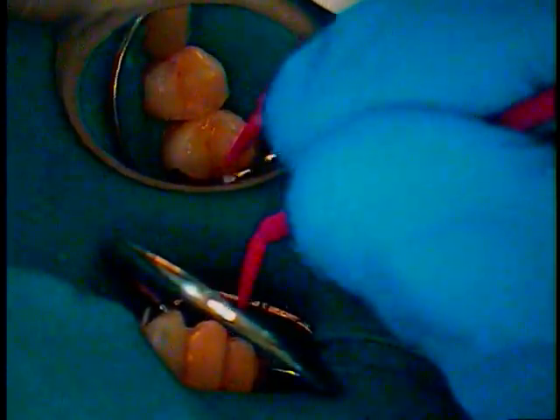Now 3M wants us to scrub for 20 seconds on the dentin. And this preparation is very, very, very conservative. We're doing a really good job of keeping them isolated. Okay, now I'm going to thin it out as I don't want any pooling before I do my 20-second bond. Okay, 20-second bonding coming up. And we light cure that. Now you got a good seal, got your bond material in there.